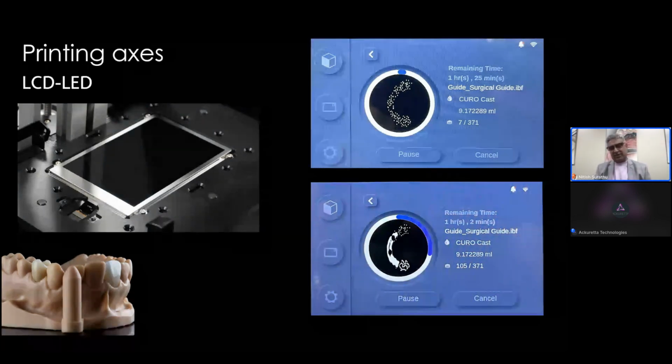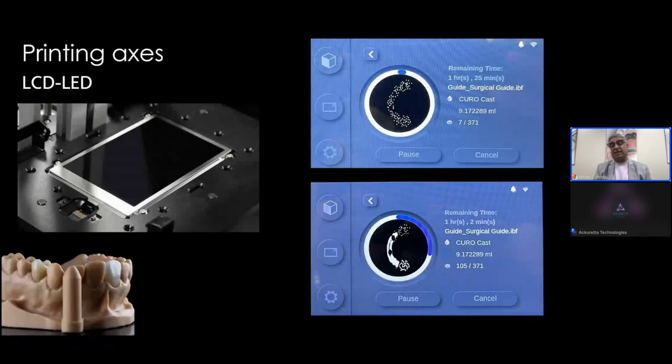I'm well aware that I'm using a castable profile there, but that I'm using a resin that's completely different altogether. But in your case, if you were not testing stuff like I do, and if you're not experimenting, if you were doing a regular print, that resin profile and the material and the application that you were using it for would have to be in sync, of course. I don't have to tell you that.